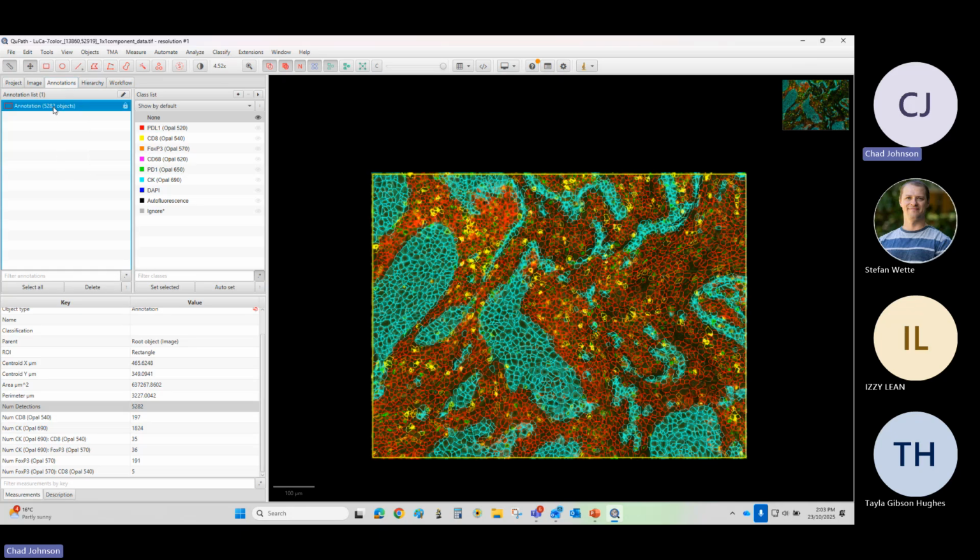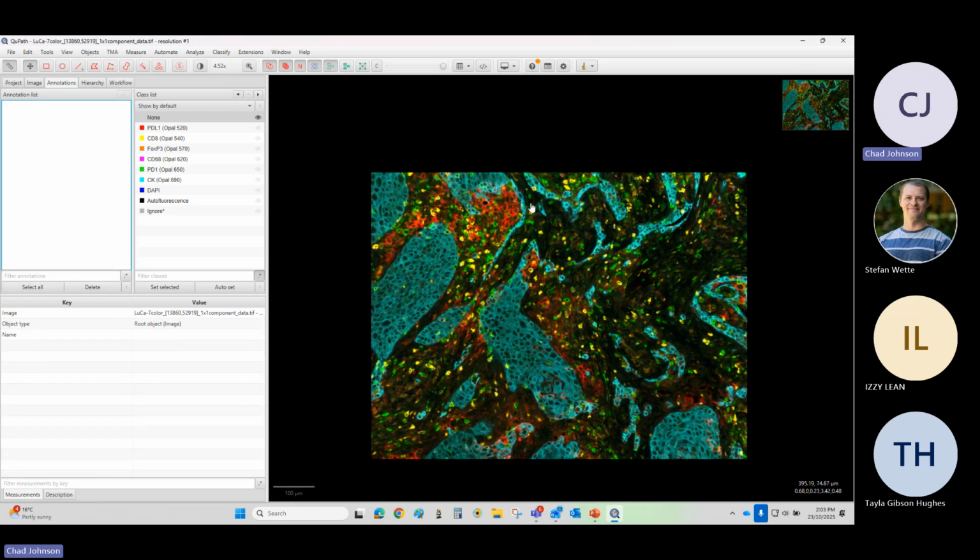Can I hide it? I'm just going to delete it. I can redo it if I need to. So I'm going to delete all of that. No, I'm done. So now I've got a blank slate. What I'm going to do over here in the class list is create a new class, and it's called training data.